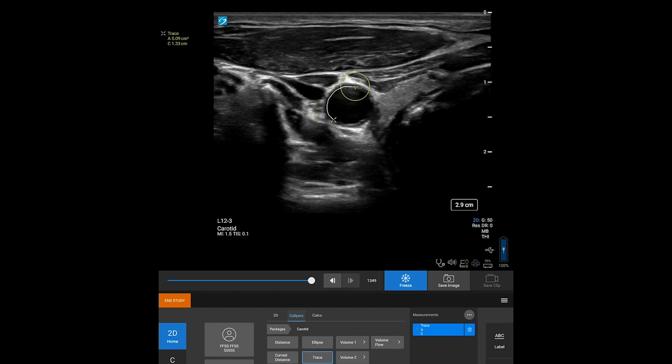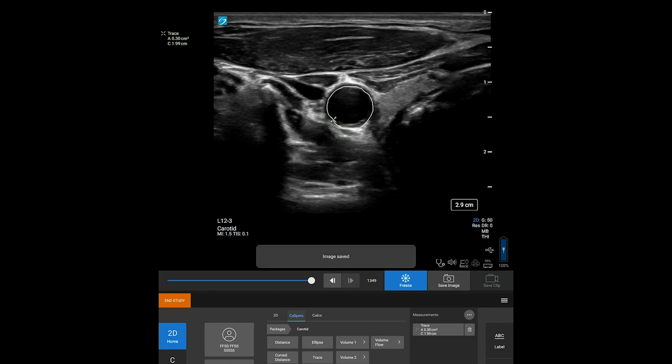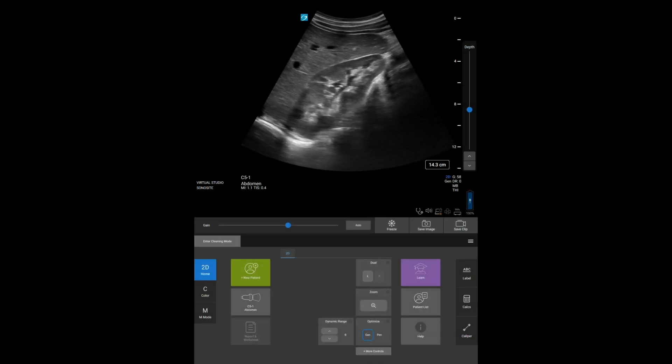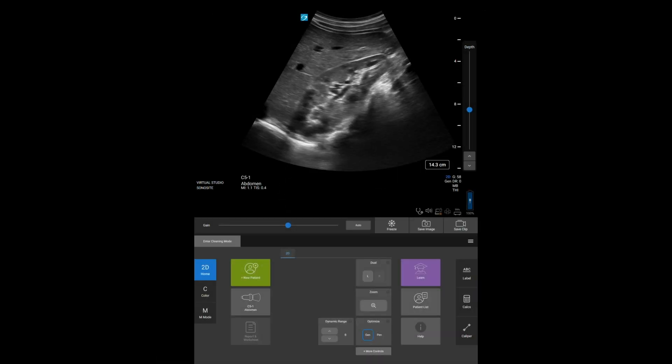Basic measurements appear on screen only and are not in a specific report page. Because of this, we recommend that you save the image with the measurements before ending the study. You can also save a measurement to a calculation or patient report.